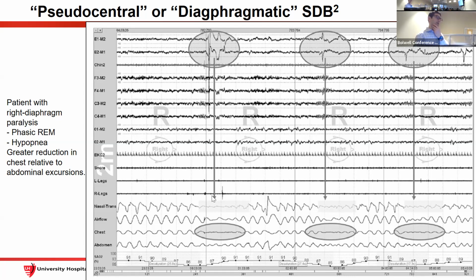Because, like I said, there's at least 3 mechanisms. One is airflow resistance, either upper or lower. One is increased chest wall compliance, so when you breathe in, your chest wall will be floppy. Another one is decreased lung compliance. So looking at the tracing, you have to say, gee, how could I figure it out? I have to sit down with Keenan, and he said there are indices that we can look at to figure that out. That's ribcage abdominal relative motion.